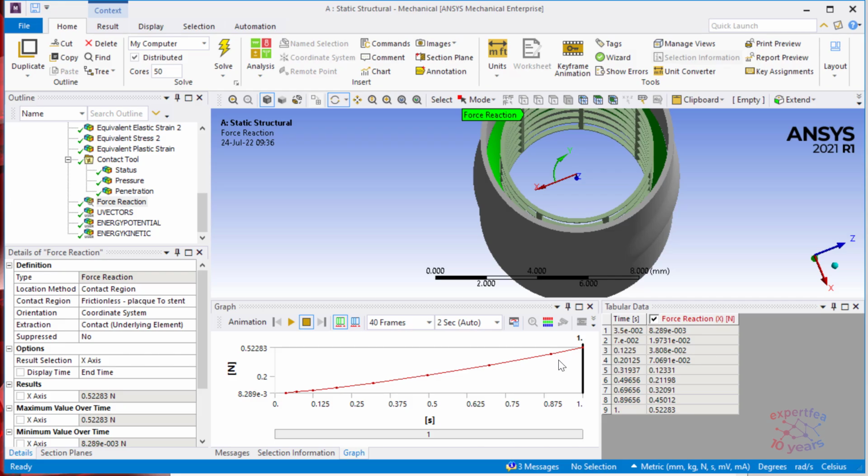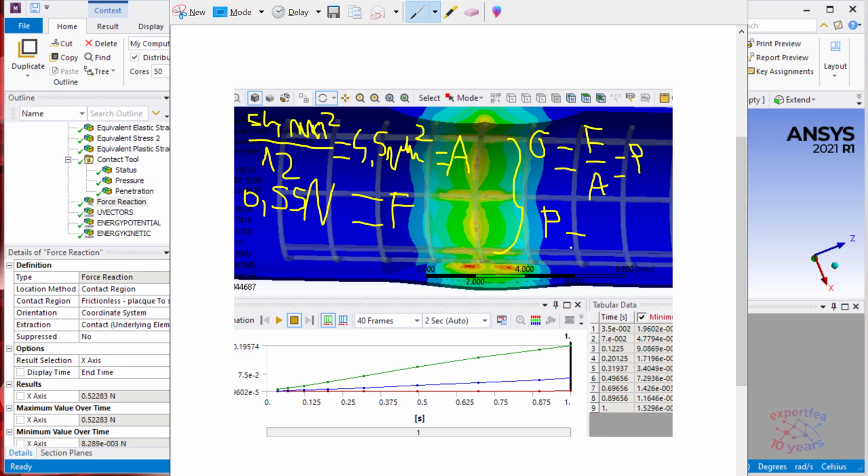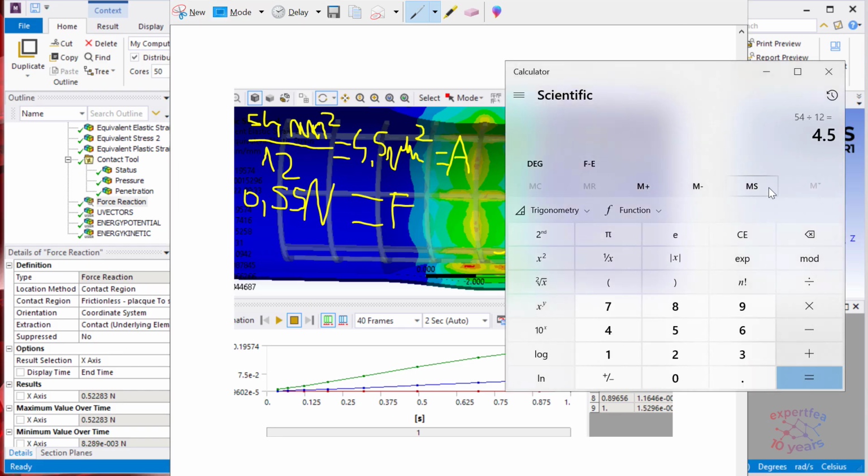Look here, 0.5. So this is the proper area. The force reaction is this one. So if we are going to use this in a formula which somehow is the pressure, then we have, let's say, 0.55 over 4.5, which is, let's say, around 0.1, I think.